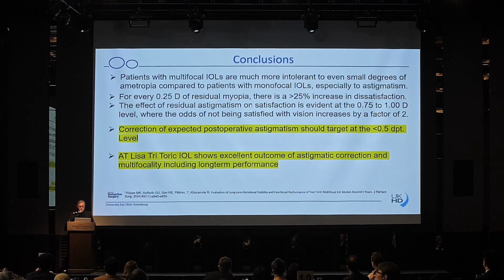So we come to the conclusion that with multifocal IOLs, of course, we have to satisfy the patient by hitting the target. And you heard Anger's lecture about the IOLMaster. You have the tools to do that, and the impact of residual ametropia can be one of the most important reasons for dissatisfaction.